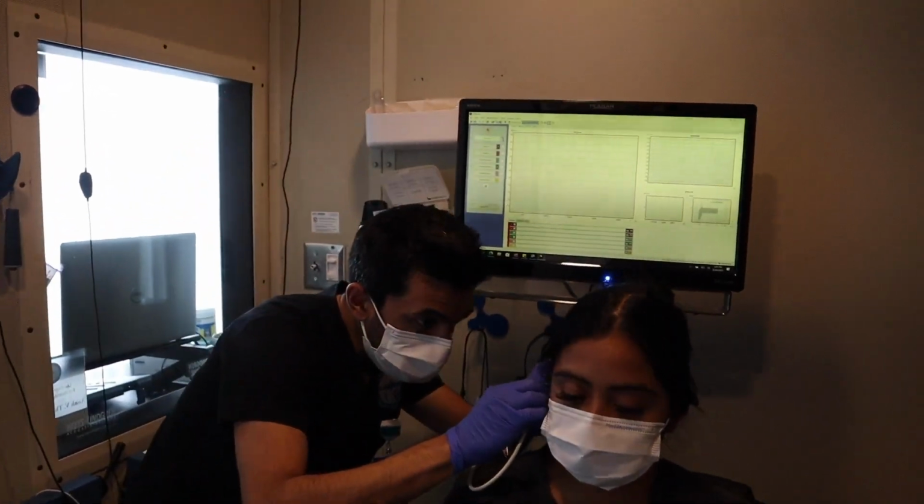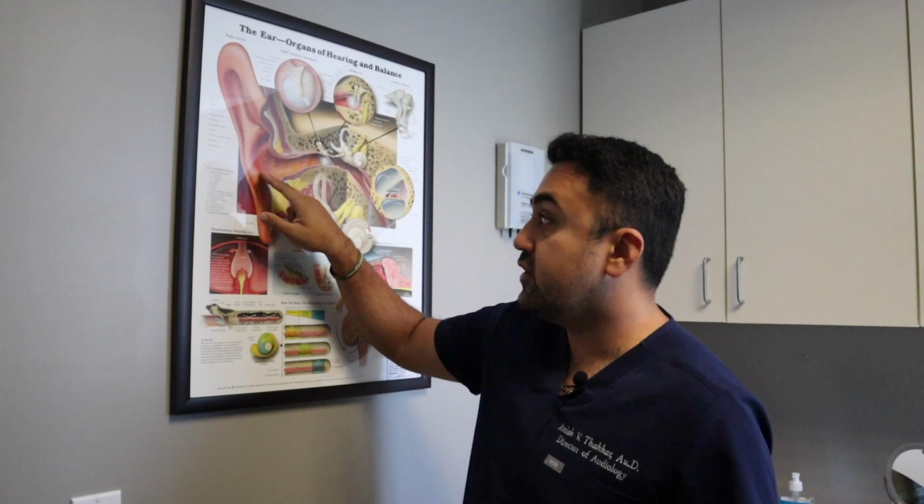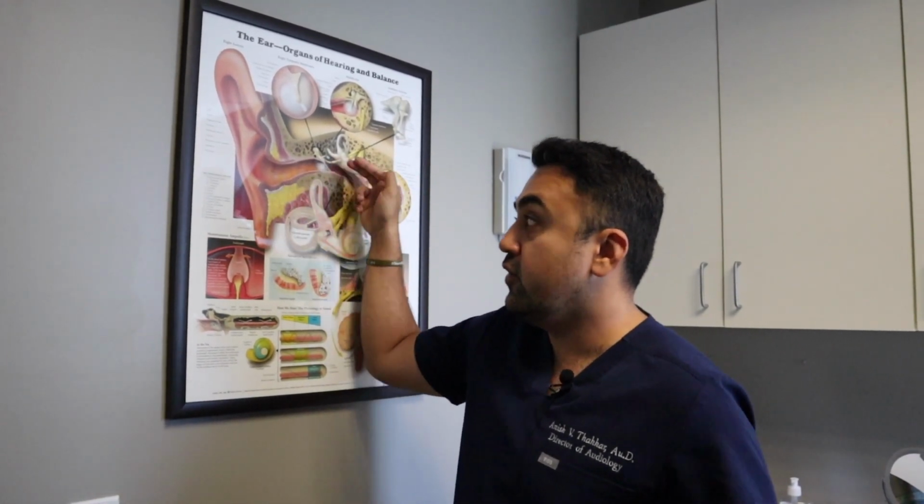During this first part of the audio exam, the patient's just sitting there quietly, hearing some tones, but what we're doing is we're watching the two tones that we send in to the ear. We're essentially recording the one distortion product that comes back out.